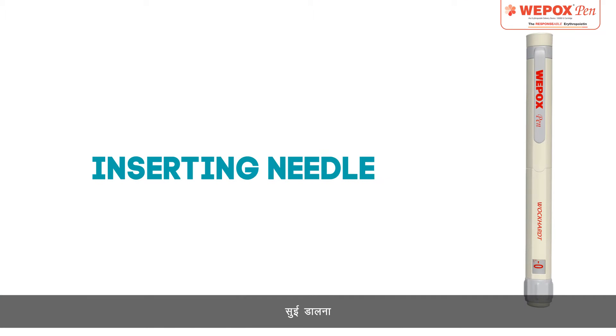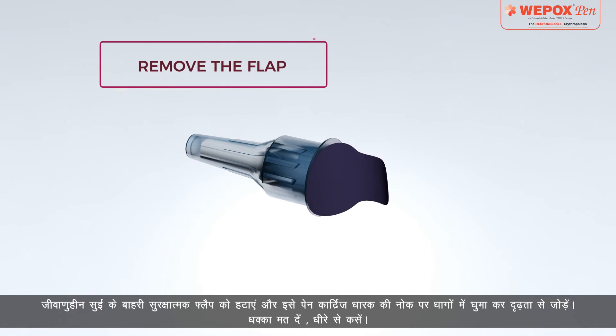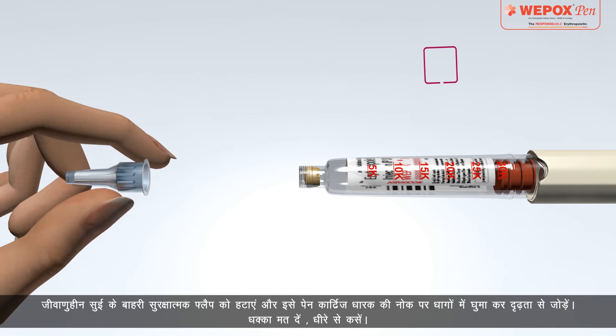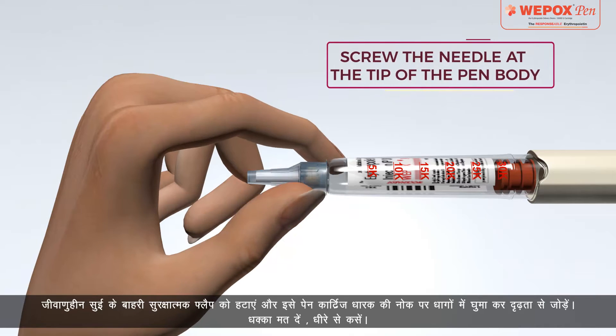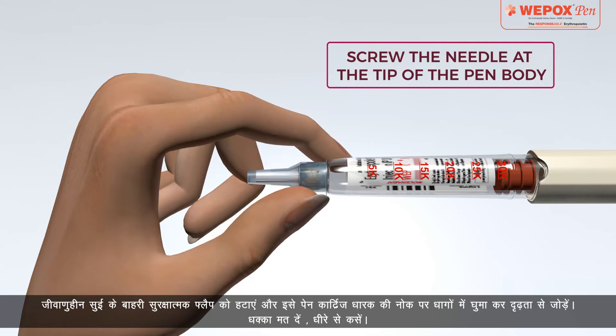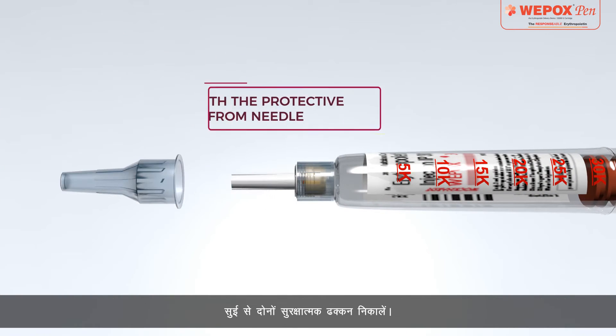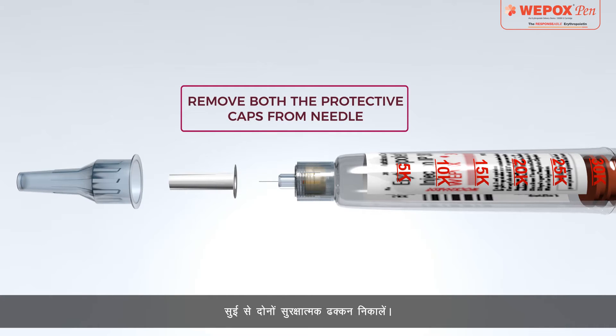Inserting Needle: Remove the outer protective flap of the sterile needle and attach firmly by screwing it into the threads at the tip of the pen cartridge holder. Do not push — screw gently. Remove both the protective caps from the needle.